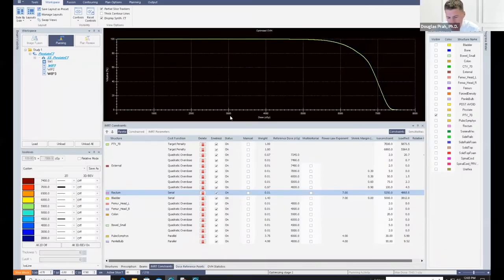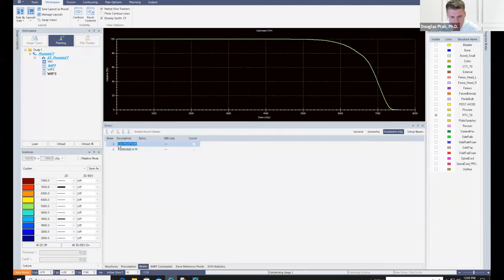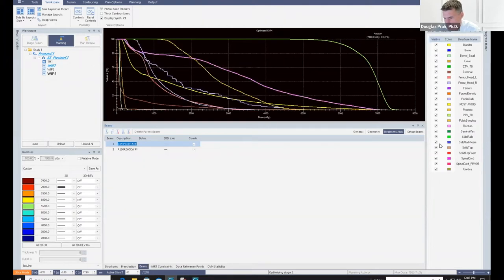If you have more than one arc per plan, on the first pass through it'll work on the right side of the bank, and then on the second pass through it works on the left side of the bank. The SSO will run through each arc in order. So the first time through, it's going to spend most of its time making adjustments on this arc, and after it's done with this one, it'll move to the second one. In the beginning, you'll see the plan quality degrade pretty quickly, and then it'll bounce back over time. This is stage two. I'm just going to turn off the stuff we're not really caring about in this plan, so we can get a better picture of what's going on here.